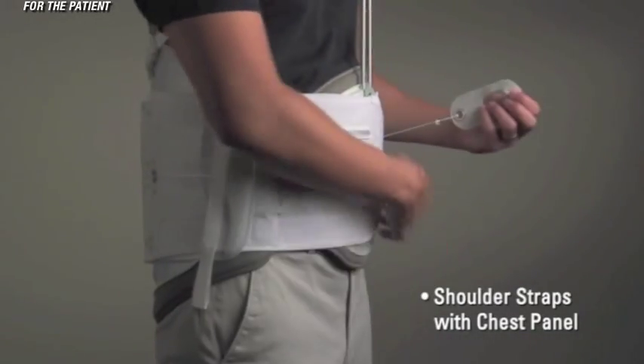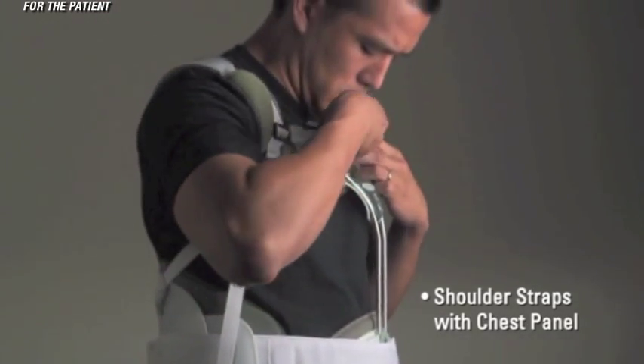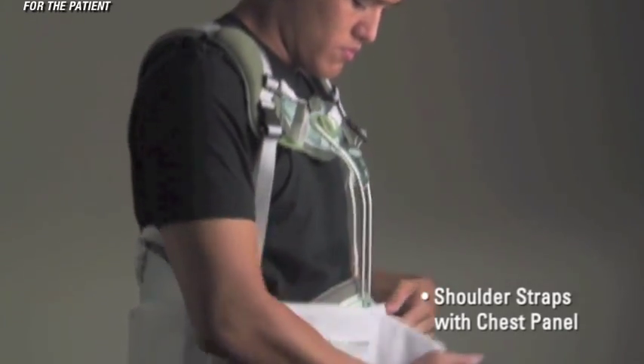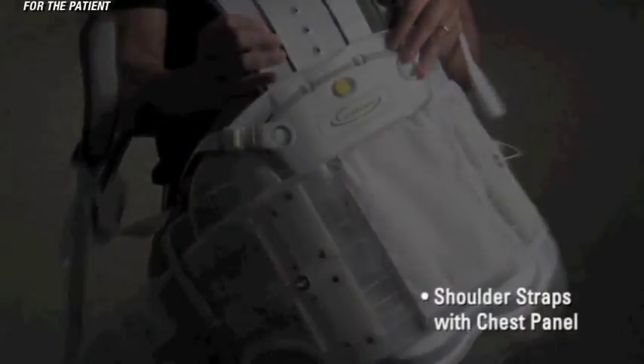When removing the Contour T LSO with chest panel, first remove the pull tabs and reposition. Unclip the horizontal chest strap from the chest panel and loosen to create enough slack in the shoulder straps to slip the brace off like a jacket.